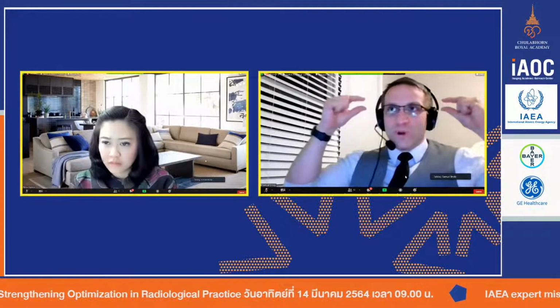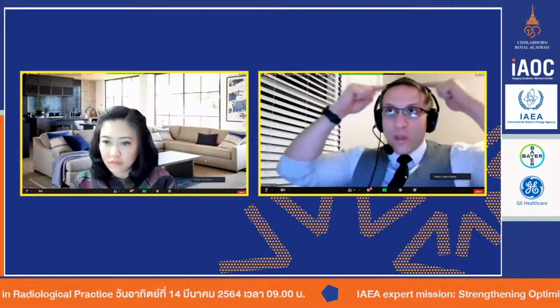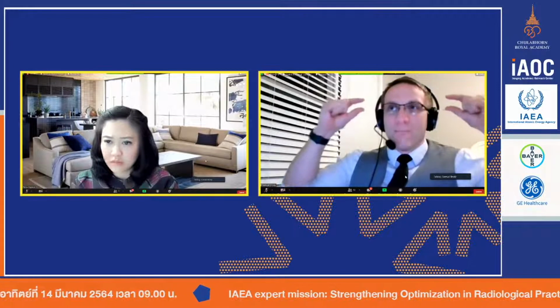And so when we build the protocol, we acquire everything at 0.5 millimeters, but the dose level, the mA, is set so that we will eventually reconstruct it at, as an example, 5 millimeters. And that's what the optimization team has to decide.